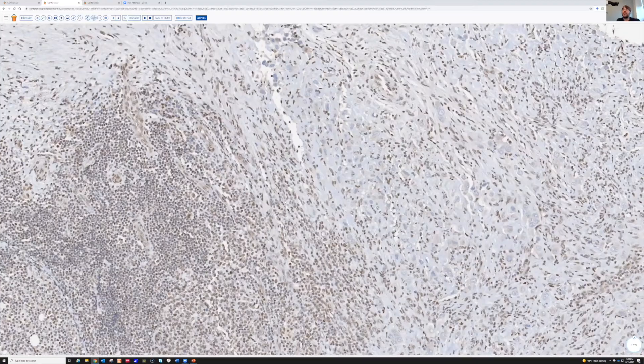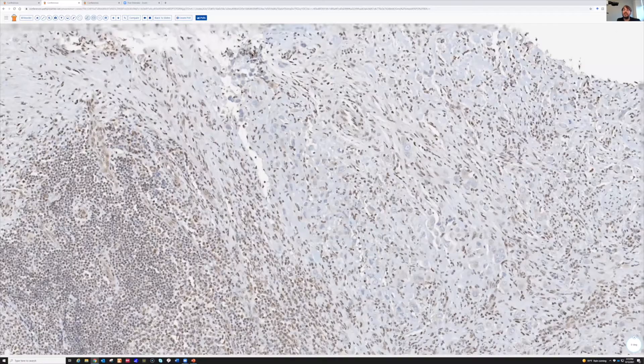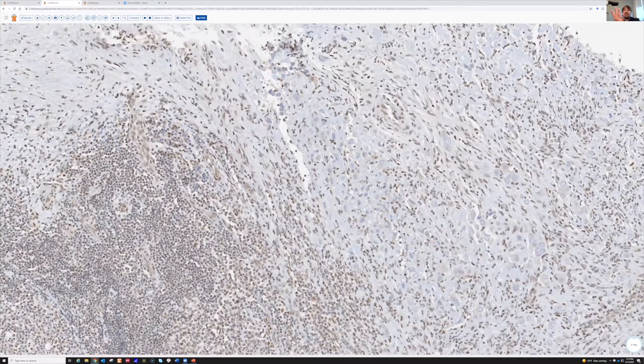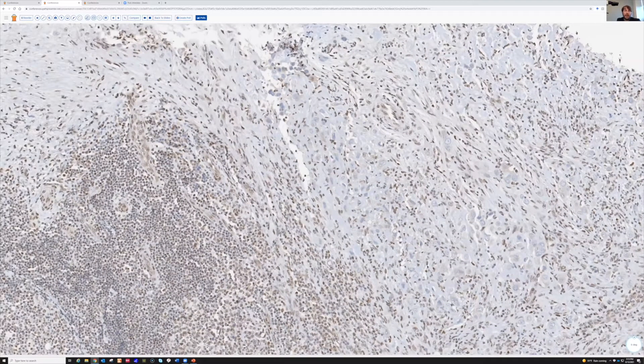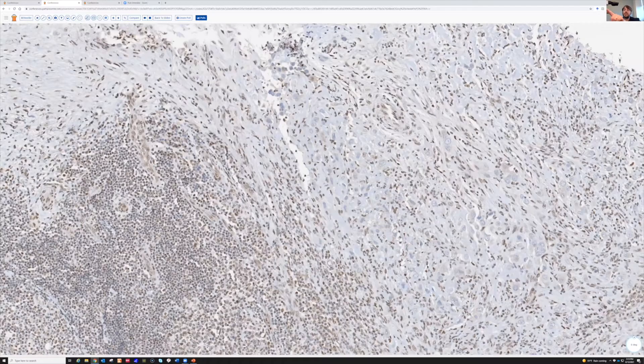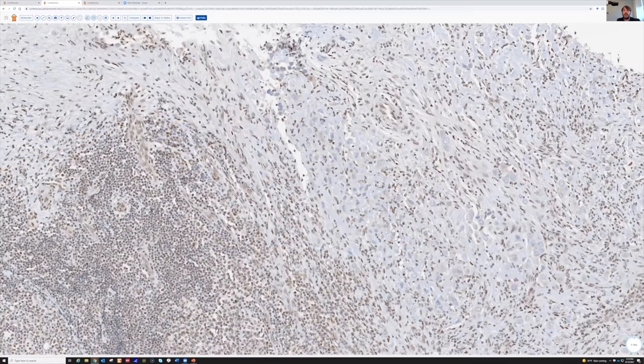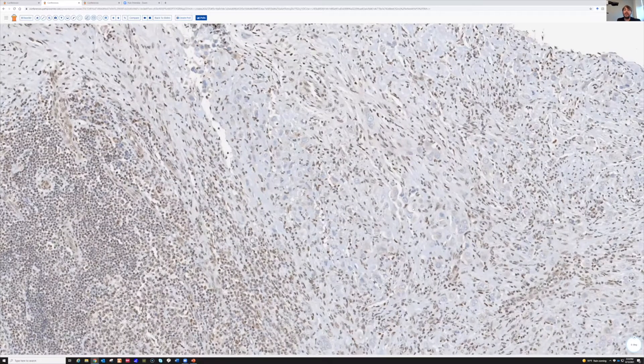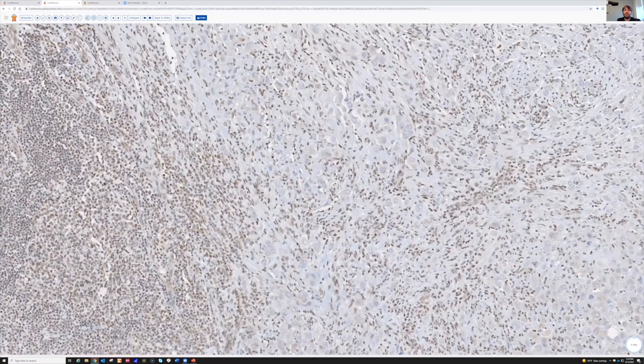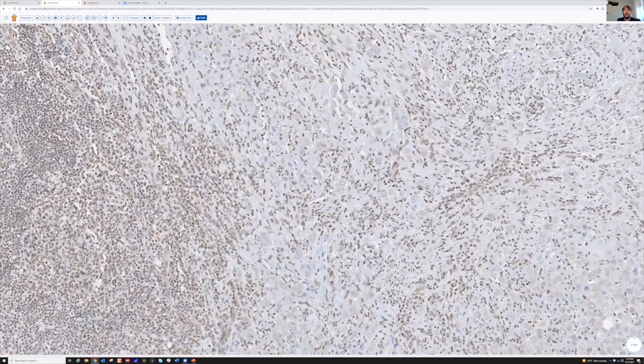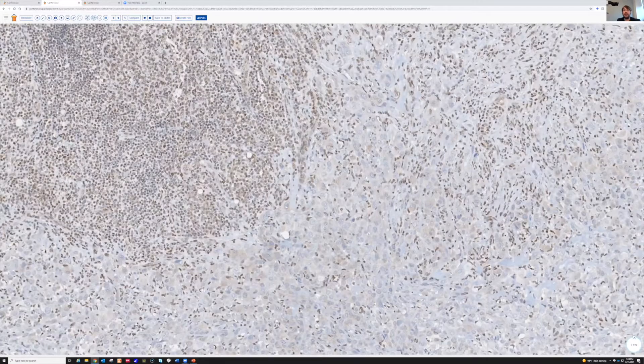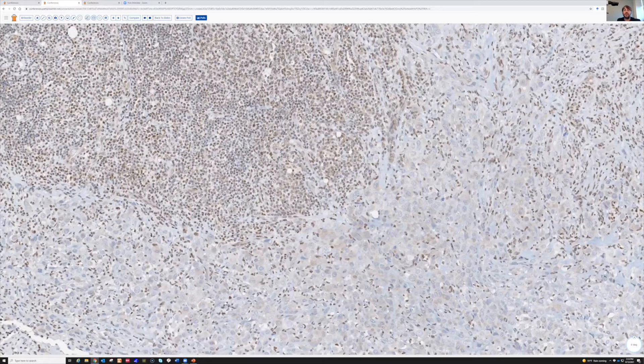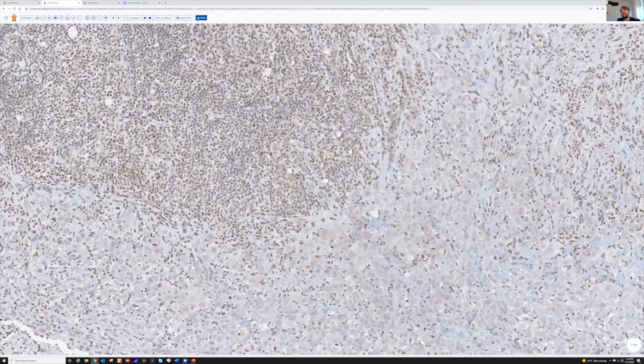Look at that. You can clearly tell these big atypical cells are definitely negative when you compare them with the background lymphocytes, right? This is what you're looking for - total wiped out loss in the tumor nuclei, as opposed to the background normal control, the endothelial cells or the inflammatory cells.